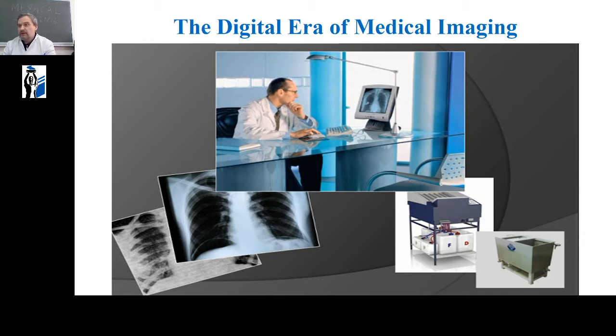Radiologists who have been working in the specialty for more than 20 years remember such things as a developing tank, fixative and developer solutions. Then there were machines that developed the film automatically. The X-rays were only on film.